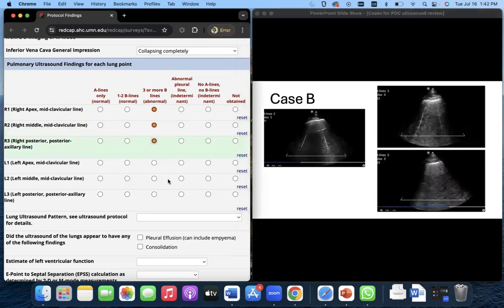Yeah, I'd say the same probably for R3. And if you look there at R3, at the very end of the image, it almost looks like the pleura. I can't quite tell, but as long as the ultrasound machine was being held still and wasn't slid on the patient's body, you get to see a little bit of a pleural defect with one of their deep breaths. And so there's also some irregularity to the pleural line visible as well.